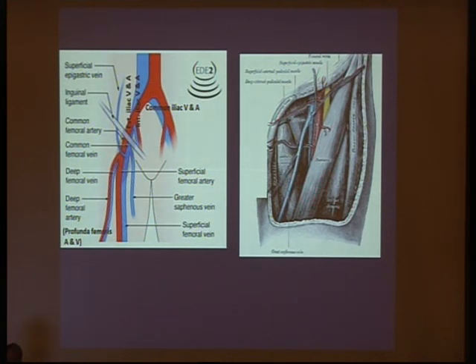That's why we sometimes cannulate the vein, but we fail to pass the guide wire. And it is sure it is a vein, but the guide wire is not going well because we are either here or there.